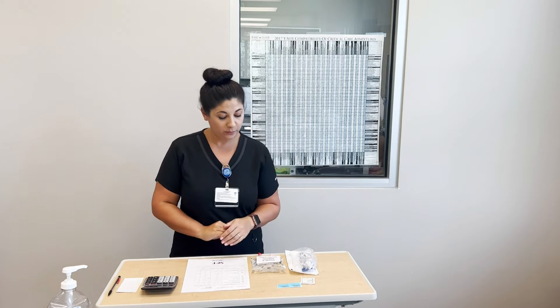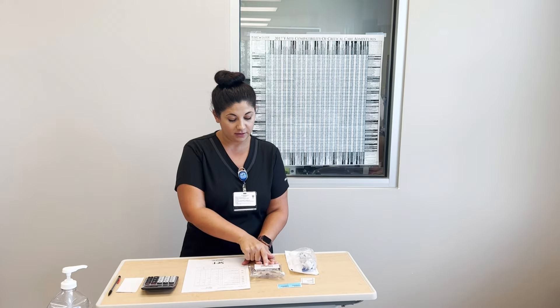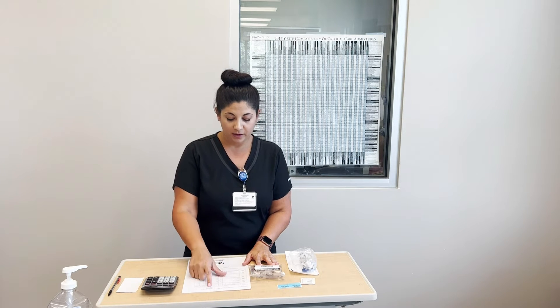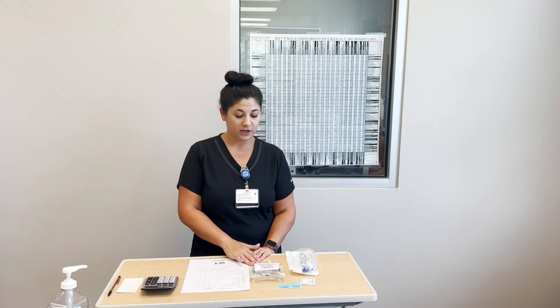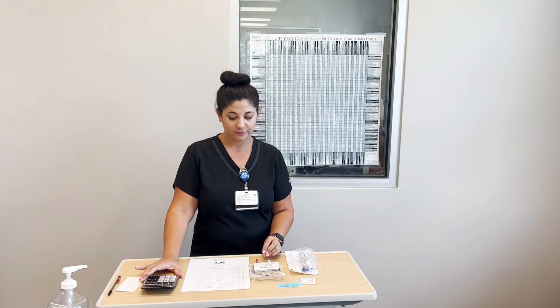Once I've determined they are compatible, I will do my second check on my IV piggyback. I'm going to state the name of the medication on the MAR and on the medication, state the dose on the MAR and the medication, double-check my route is IV or IV piggyback, and check the time and the frequency. I have looked at my drug cards to determine how long I need to run this medication over — that information comes from the drug book. I've done my calculations and determined that I will be giving this medication at 28 drops per minute. Now I will gather my equipment and go to my patient's room.